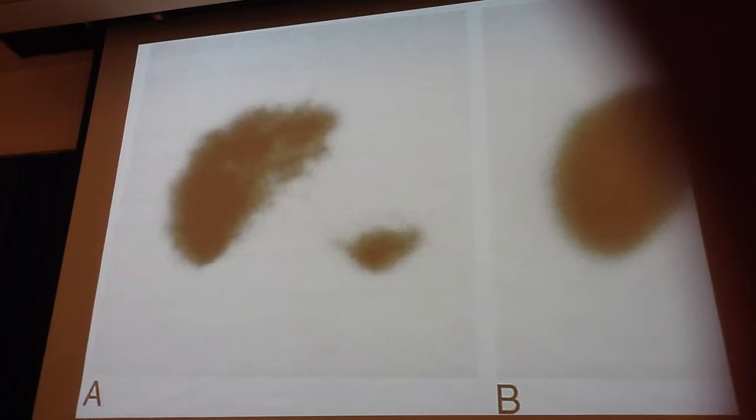In our repertoire of filters that we have available, some of the ones that you're going to hear about are the Hamming and the Butterworth filters. Have you seen those?